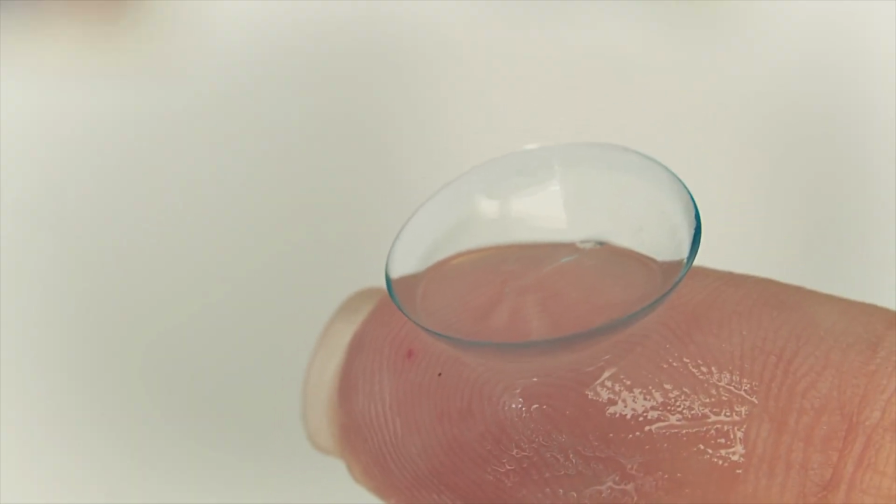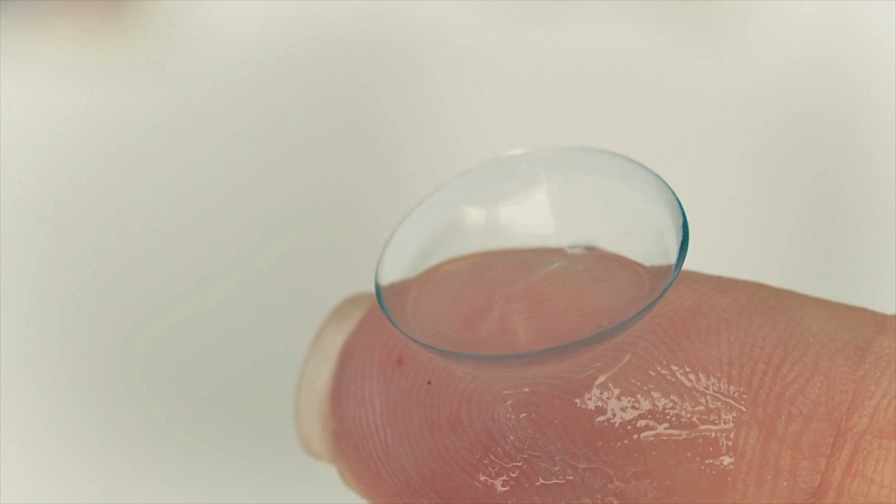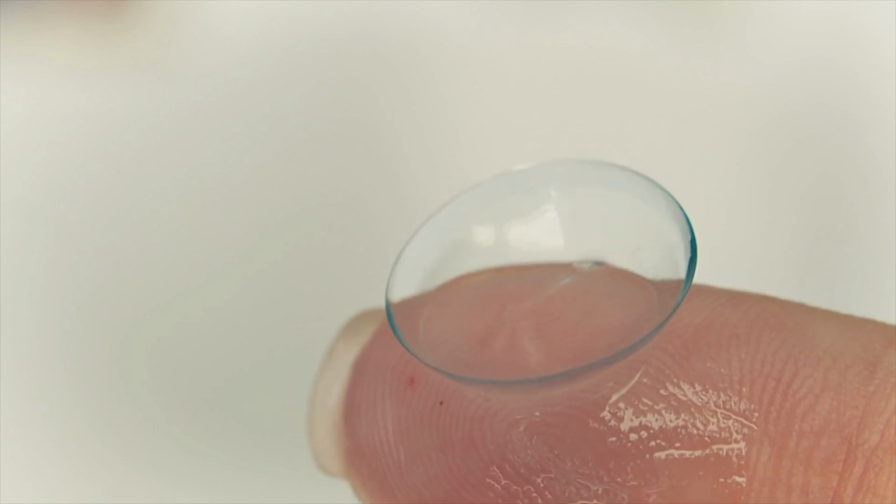I don't like a really wet lens. Some people add solution to their lens, but I find that the drier your finger and the drier the lens, at least not dry, but at least not dripping wet, the less the cohesion between the lens and your finger, the more likely it is to go onto your eye.